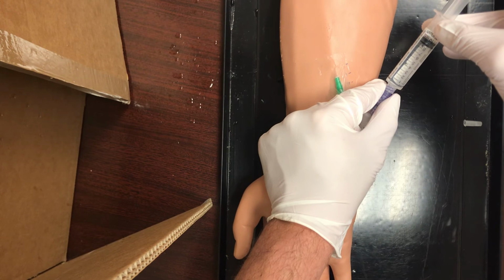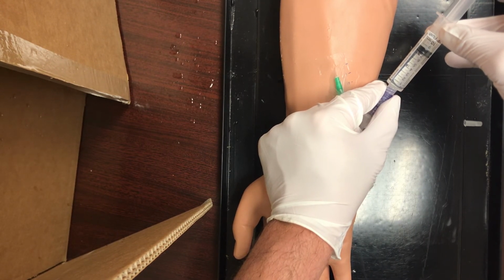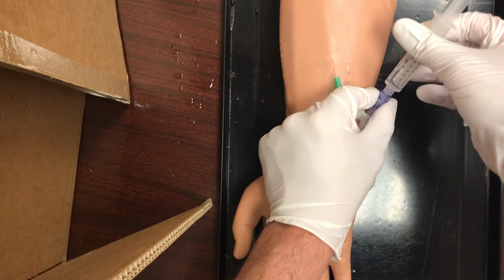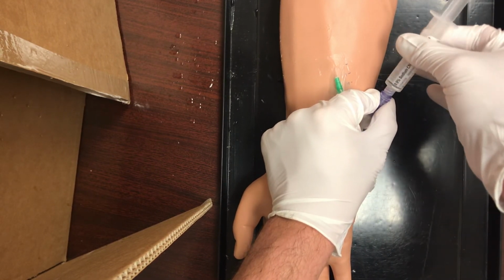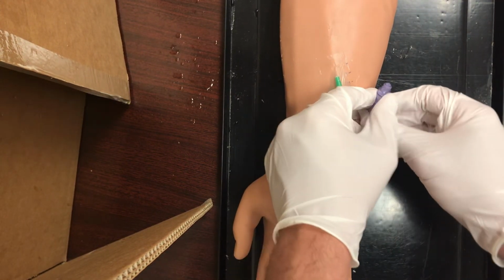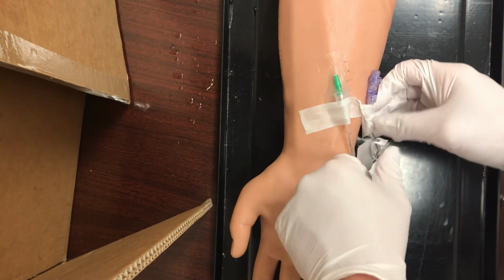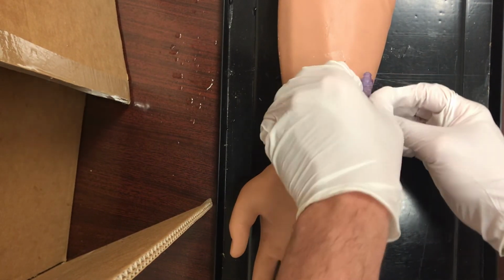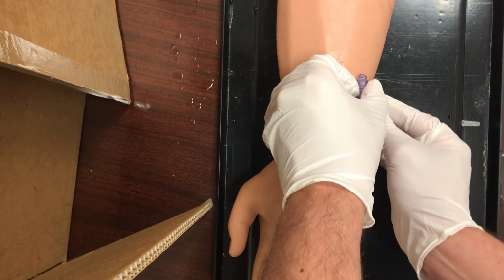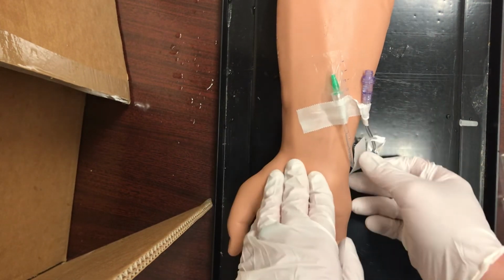When we flush, you can go at a slow, steady rate when you just want to do a flush, and you're going to flush 2 to 3 mLs. Okay, that's in. Once we flush our 2 mLs, we can remove that. This can either be capped, or you can leave it as it is. Just make sure that when you do that, you clean it for 15 seconds prior to administering fluids or medications. All right, this doesn't stick too well on the artificial arm.